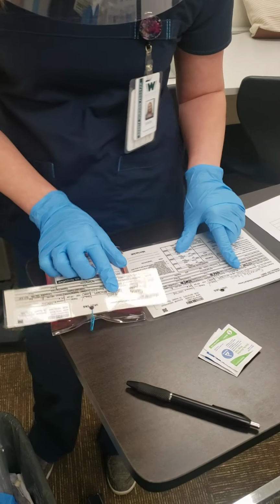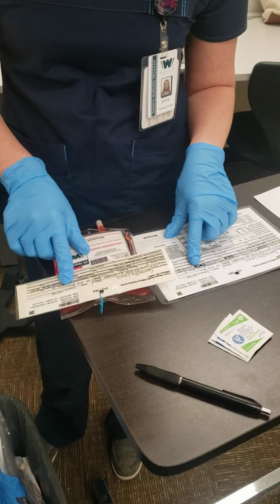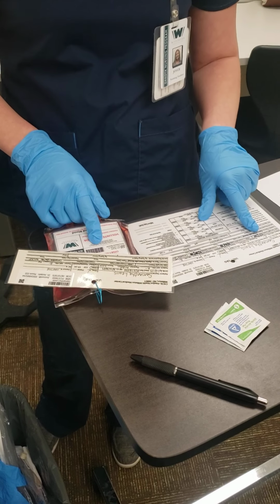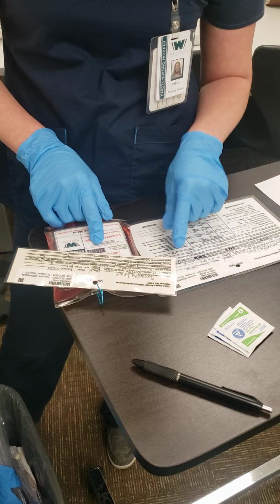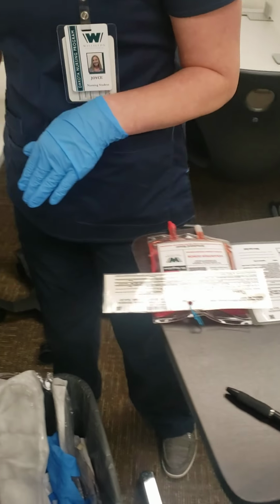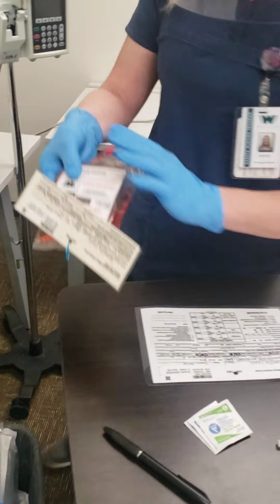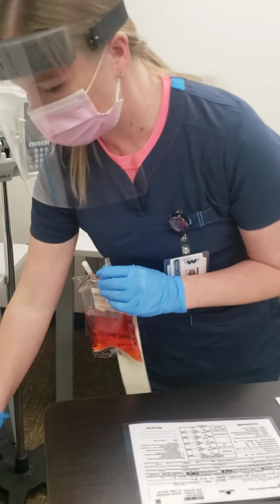So I have Samantha Lewis, AFN 3889, donor number 120708, birthday 6/10/1975. The sample was drawn on the 1st, cross-matched on the 16th, and expires on the 30th. They are both compatible, and they are B negative. And once again, that matches up with my client's wristband and her green band. So now I will go ahead and prime this tubing with blood.